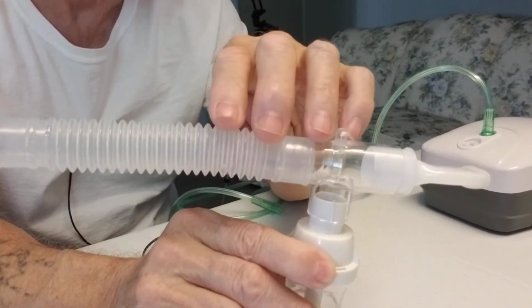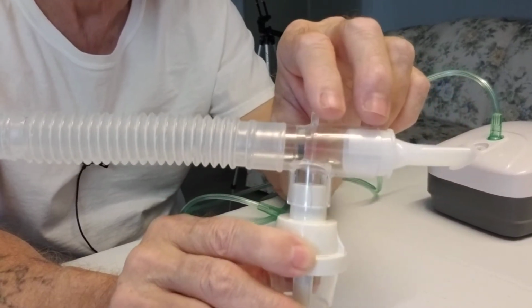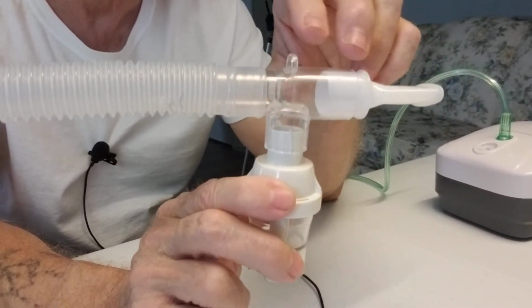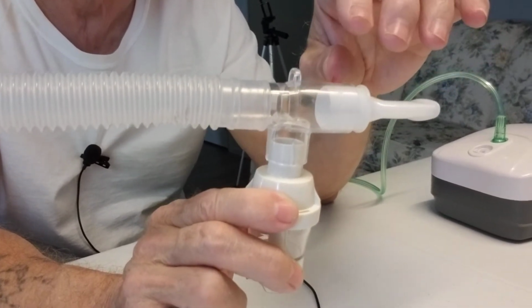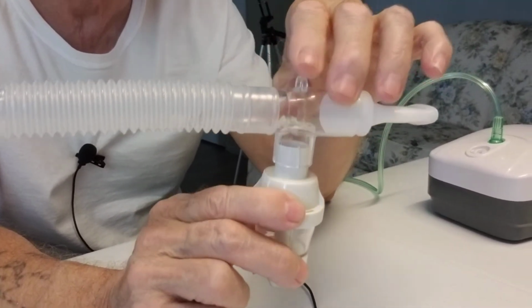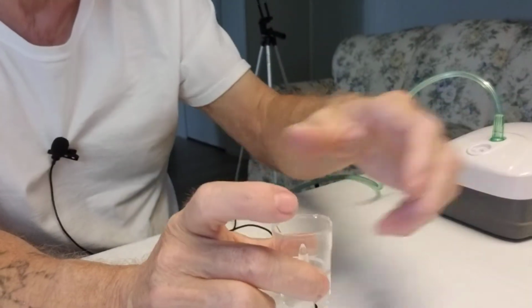What you want to do is you want to inhale through your mouth, exhale through your nose. Do this deeply, continuously, and it will make you feel much, much better on a bad day when you're having breathing problems. Now, set this aside here for a second.